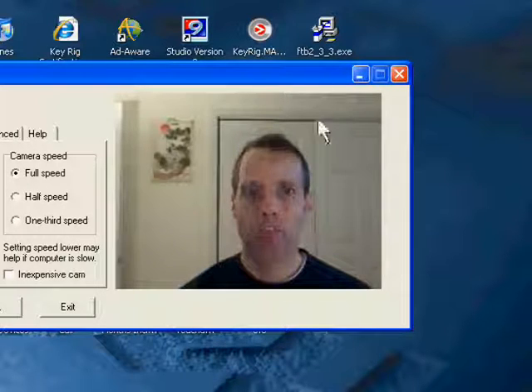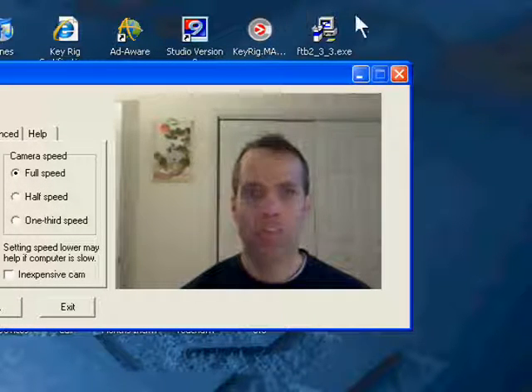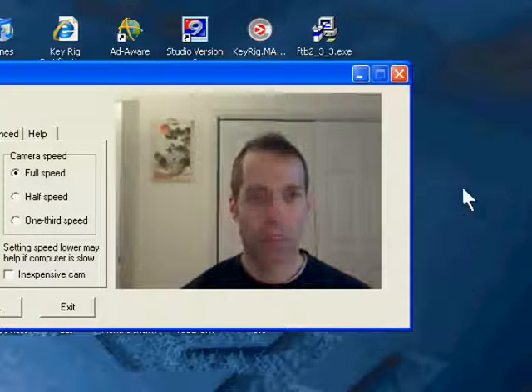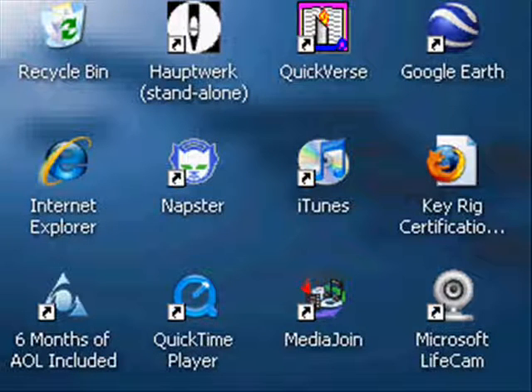Once the VivoMouse is calibrated, as you move your head, the mouse moves to where your head is pointing, and you can put the mouse pointer anywhere you want. Let's say you want to click on the Internet icon on the desktop — you just move your head until the pointer is where you need it.